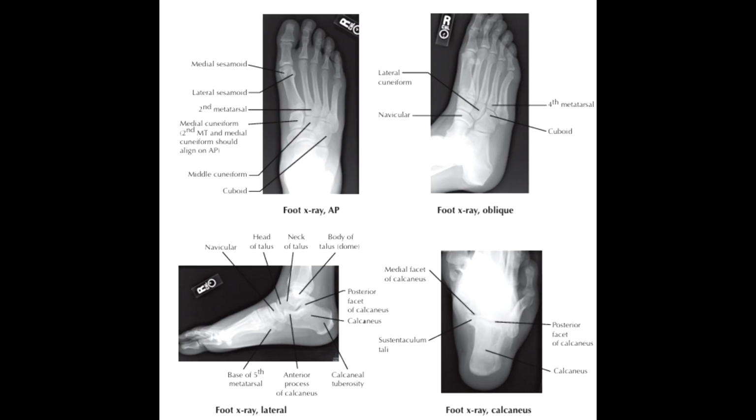Clinically, these radiographs guide treatment decisions every single day. They determine whether an ankle sprain is truly just a sprain or whether a subtle Lisfranc injury lurks beneath. They reveal whether a patient's chronic foot pain is due to a bunion, a stress fracture, or a sesamoid disorder. They dictate whether surgery is needed to restore joint congruence or whether conservative management is sufficient. In short, the radiology of the foot is not a passive tool, but an active guide in clinical decision-making.